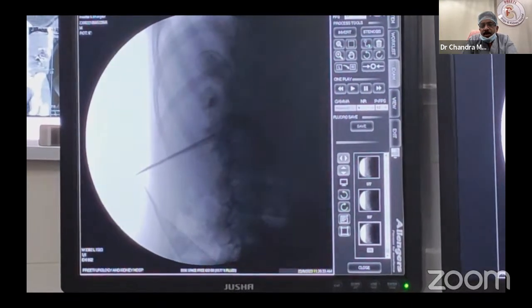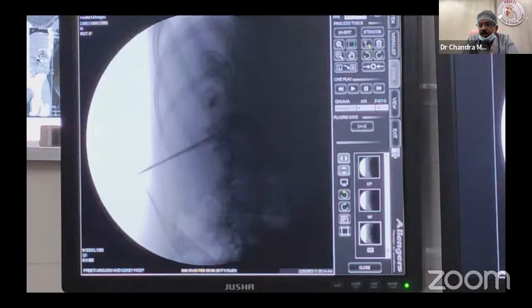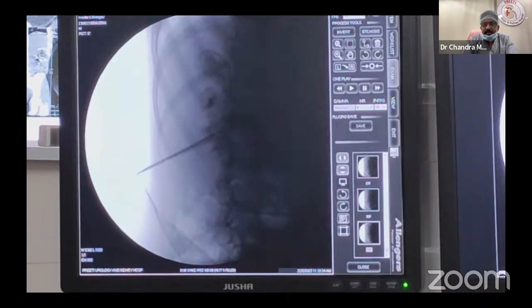Can you see that? If any guide wire goes into the upper calyx and turns into the pelvis, it is very, very lucky. The second lucky thing is if it goes directly to the ureter. But I feel if you are doing a lower or middle calyceal puncture, if the guide wire goes into the upper calyx and then curls down, you are very safe, because the dilatation can be aimed towards the upper calyx and then go inside safely in the PCS direction. Upper calyx curve, never think that it is bad, like this case.